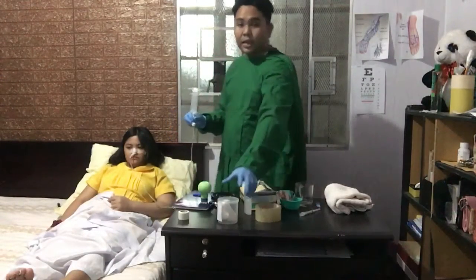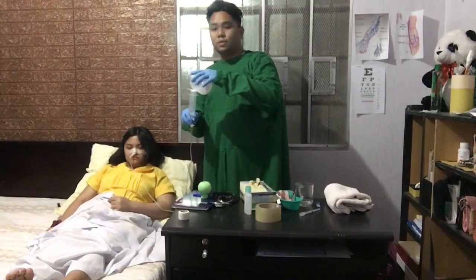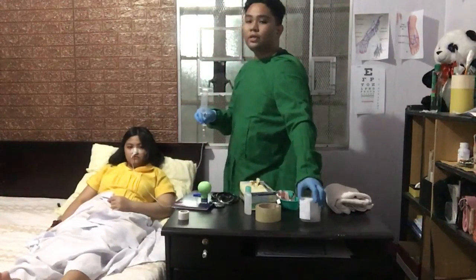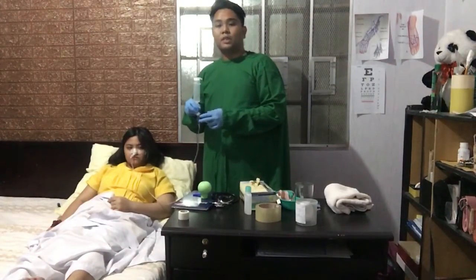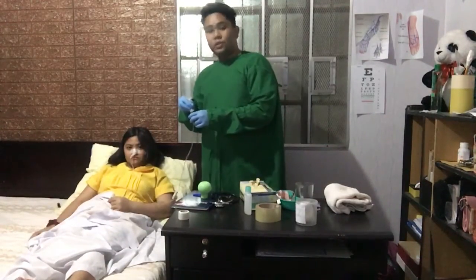Then, we pour the pre-measured amount of tube feeding formula into the syringe. Yan po. Then, we open the clamp and allow the food to enter the tube. Then, we regulate the rate, fast or slow, by the height of the syringe, so it is easier for the formula feeding to go into the stomach.